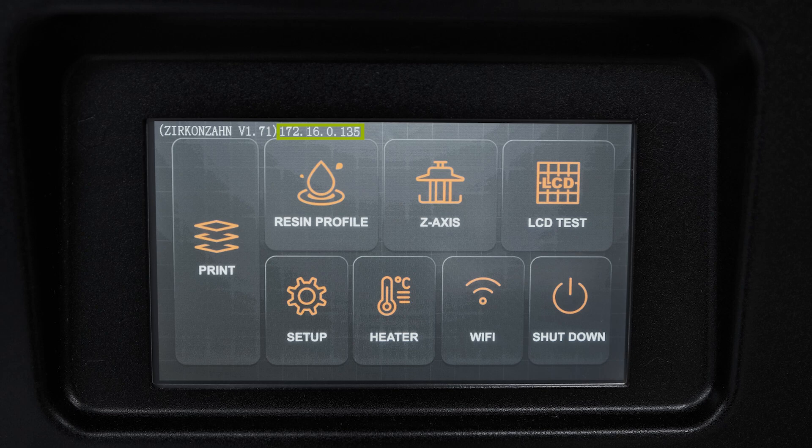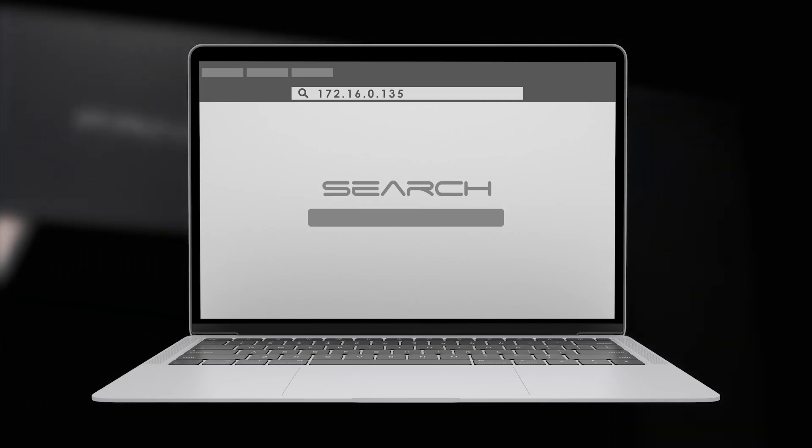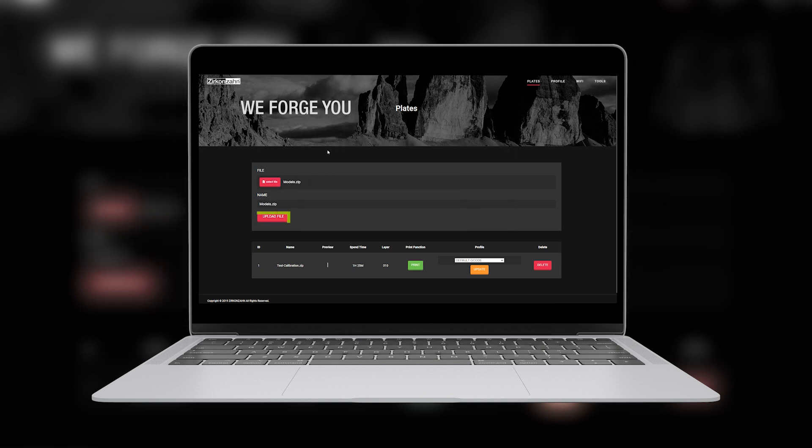Alternatively, you can copy the IP address in the browser and open the Zirconzon OS website. In this case, select in the setting bar and then click on select file. In the opened window choose the desired file and go to upload file.